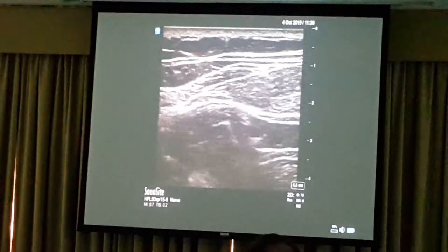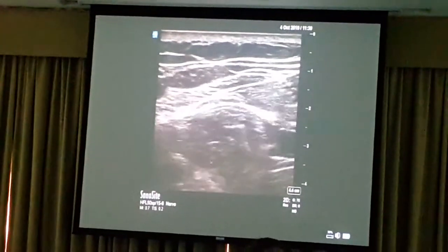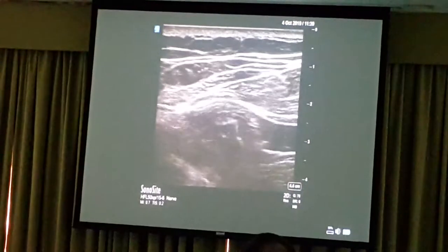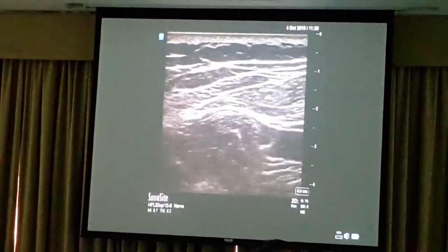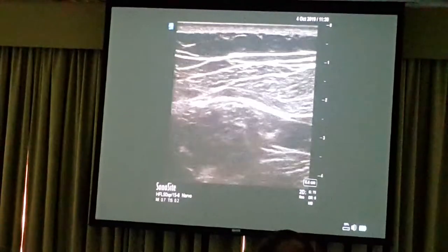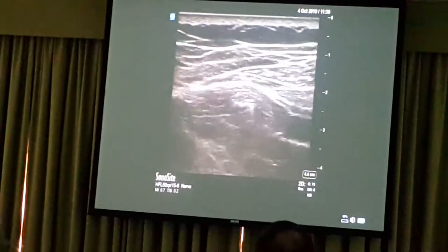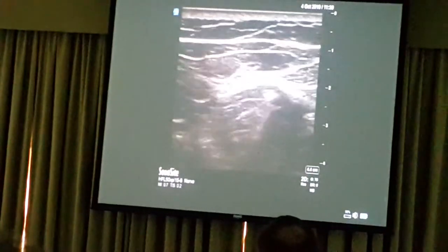This is, point here, the quadratus lumborum block on top of it. Now, if you look at it now, you can see in the top corner a muscle that comes and goes, you see, in a blink. It's disappearing, no, it disappeared here, now it's gone.